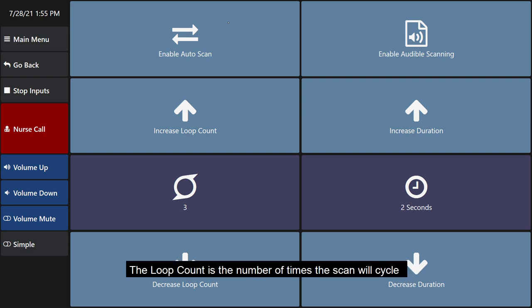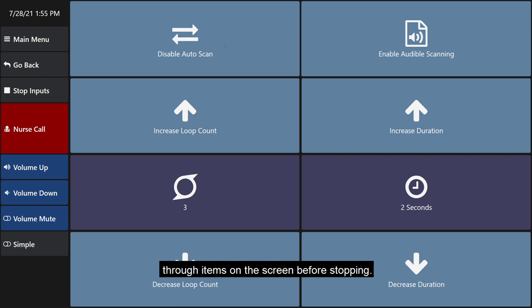The loop count is the number of times the scan will cycle through items on the screen before stopping.